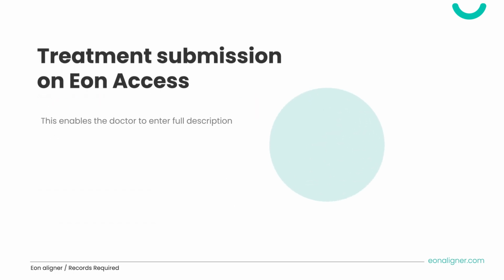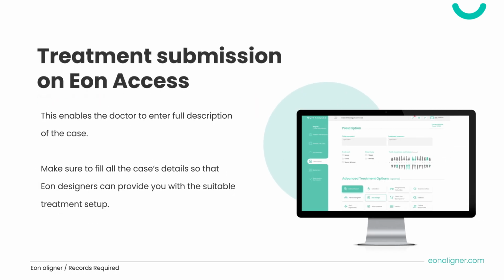The final step is to submit your case on Eon Access. Here is where all clinical findings can be reported. Also, your treatment goals, objectives, and plan can be shared with Eon's treatment planning team, and instructions or restrictions for specific teeth movements or attachment placement can be added.